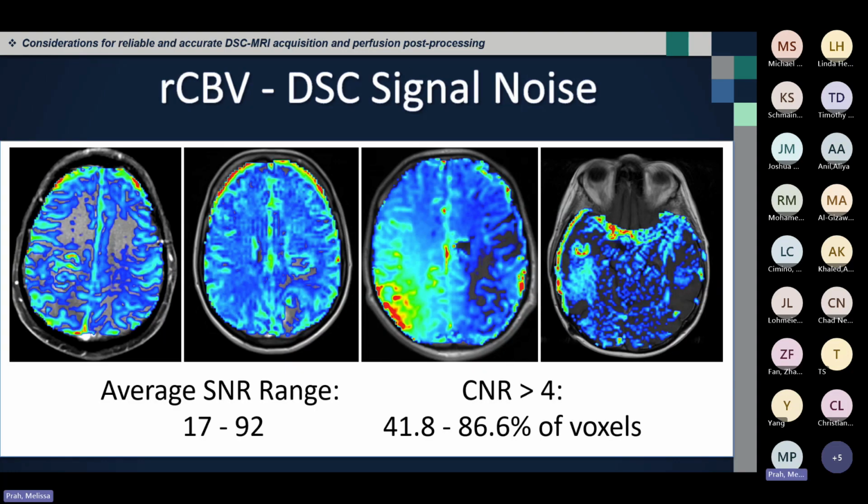Noise may be intrinsic. It could be present as an early transient due to patient motion, and especially following long scans or a seizure. It can also result from patient anxiety, or could be due to the scanner hardware, coil, or scan settings. Noise is most often seen as signal voids present in the perfusion maps.